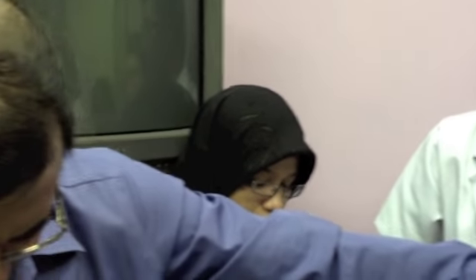Confirm again with PTA. What is PTA? Pure tone audiometry. Very good. Okay, done. So after we do this, how to comment to the examiner? You say this patient has normal hearing via the voice test because the patient can hear my conversation level voice and also my whisper. You understand? Or you say there is some hearing problem or hearing reduction because the patient can only hear my shouts.